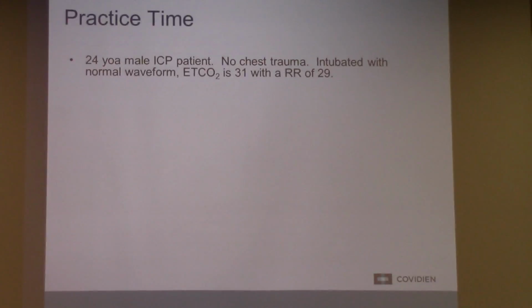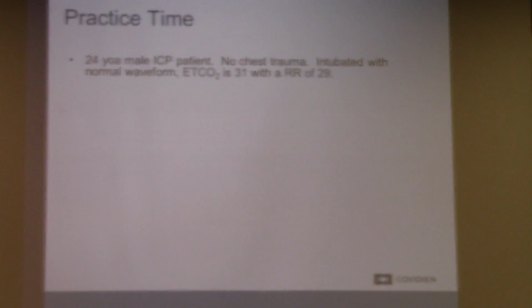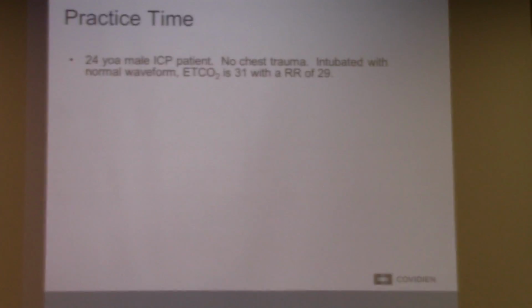So in these ICP patients, some of them don't need to be ventilated. Depending on your protocol, you're going to RSI or chemically assist or nasal intubate. But even if you can't do any of that, this all still applies with a cannula and a BVM. If you can't RSI, you can't give them ketamine and Versed, you can't nasal intubate, well then get them on a cannula and get them on high flow BVM and make sure you're doing what you can to achieve this range. So it doesn't have to be ALS level airway intervention.